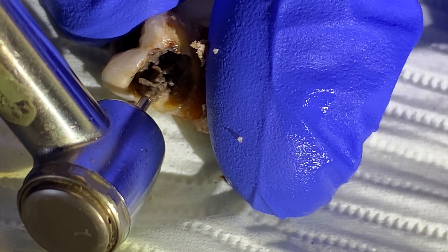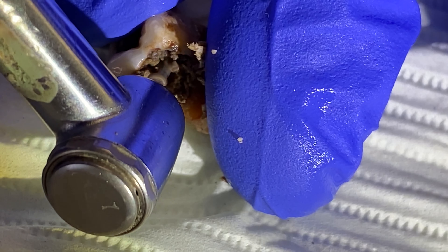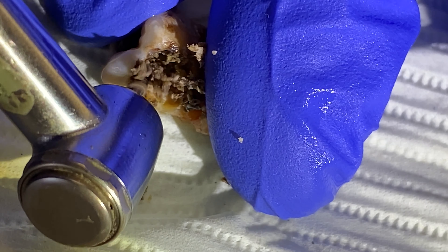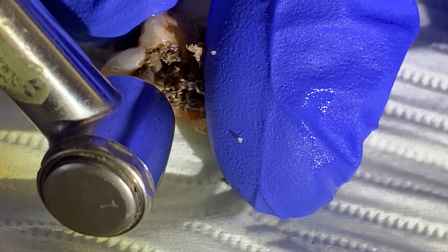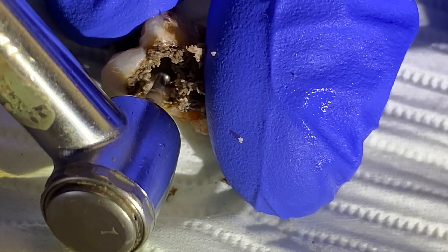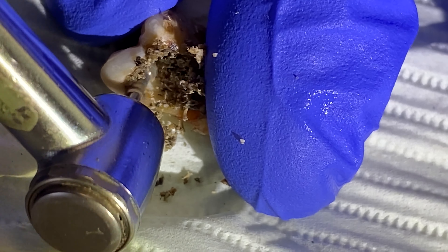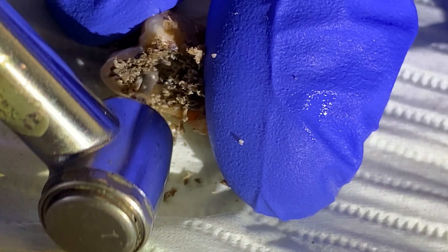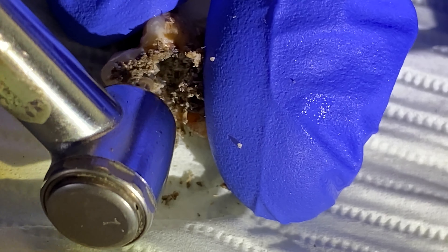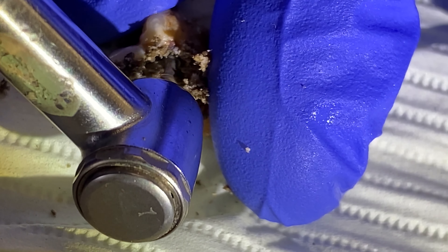Some people call it oatmeal, some people call it sludge, mush — it's all sorts of stuff. Look at all that dirty stuff. This is what they call the money shot. This is what you see when we're going into big cavities inside of somebody's teeth.